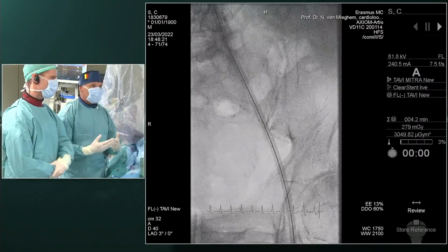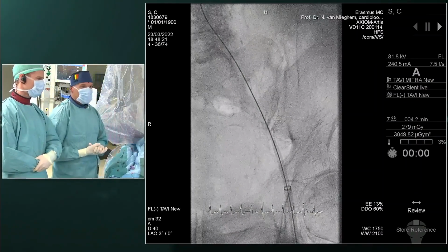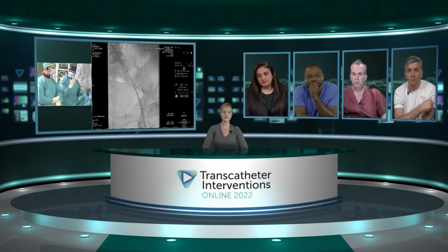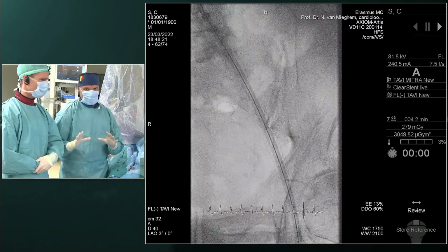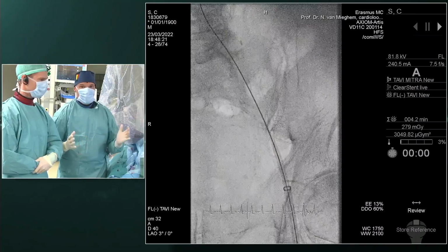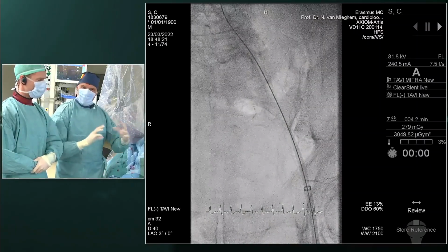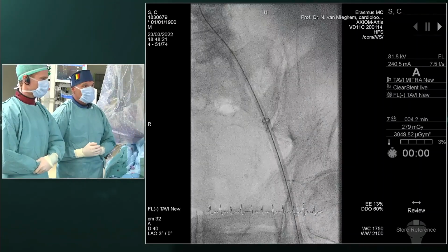The reason not to go to the right side was the circumferential calcium. That would be very attractive for a shockwave balloon, but there is this tortuosity that Roxana also mentioned. And the combination of tortuosity and long circular calcium, that is also a recipe for disaster. Because make no mistake, when you do shockwave balloon inflations, vessels can rupture, and unfortunately we lost one patient some time ago because of that. So we are very sensitive to this combination of tortuosity and calcium, and we took our chances on the left side, and it turns out to go smoothly so far.